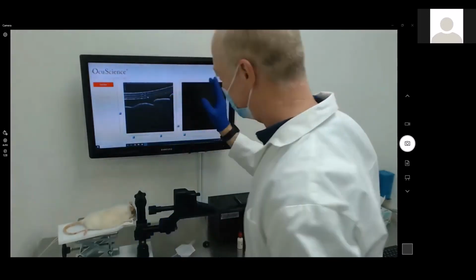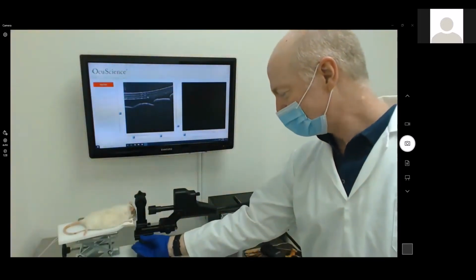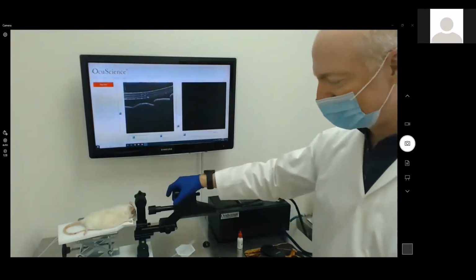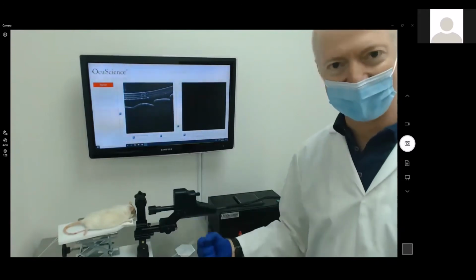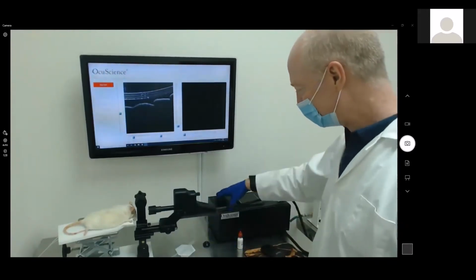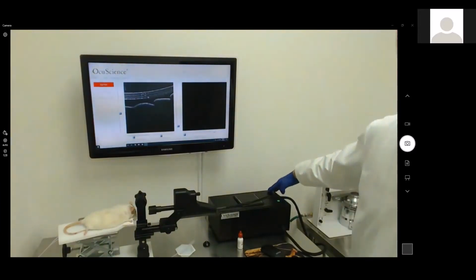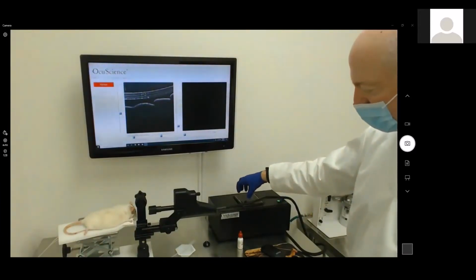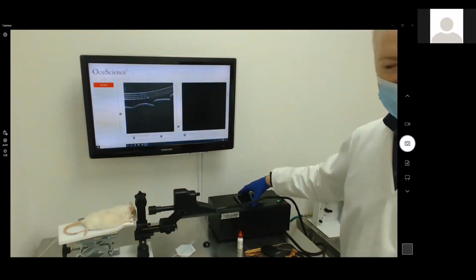So this is our OCT system. It is comprised of basically our scanner, which can be mounted as well as handheld. And then this all connects to our iVivo imaging platform. This is the OCT and also has a very powerful i7 computer platform.